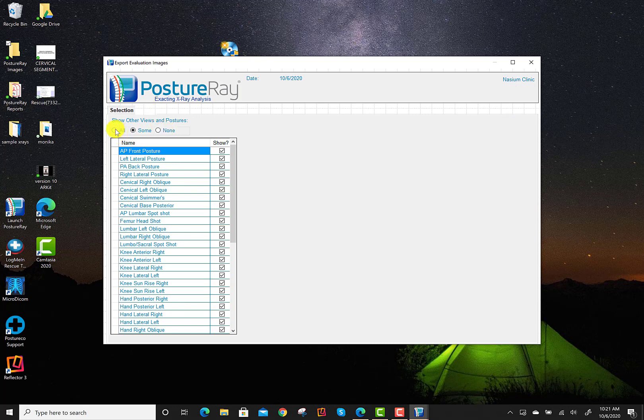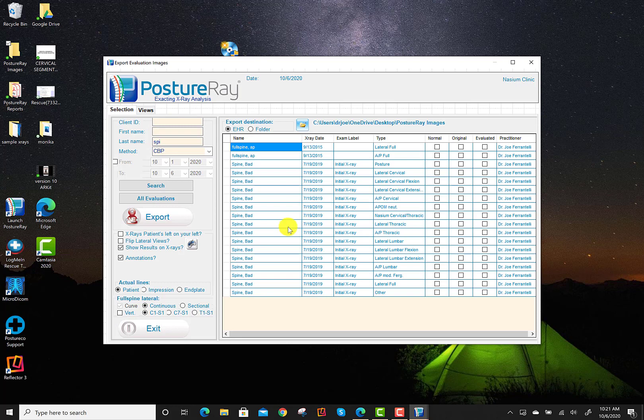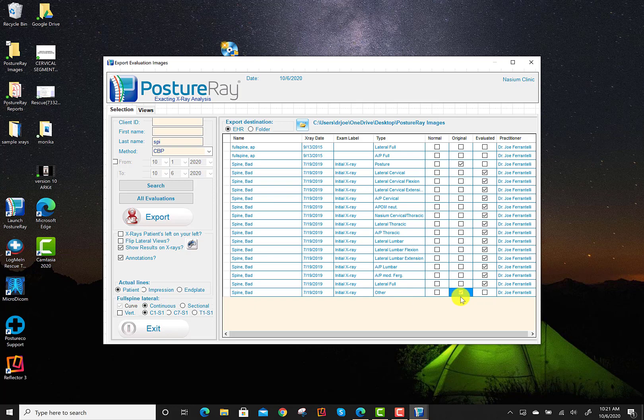I'm going to select all. And I'm going to go back into selection. So now if I click on their name, notice that I have the other here. Now, since they're not evaluated, you're going to manually click other. And that will export those additional images. Now, I have some others from a different date. If I wanted to go ahead and export those, I could go ahead and export those as well.